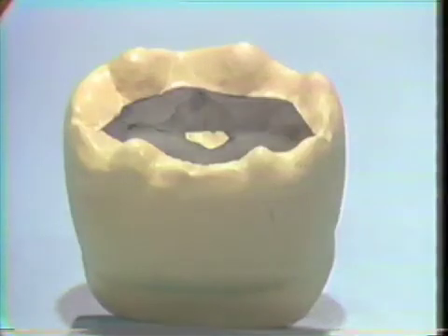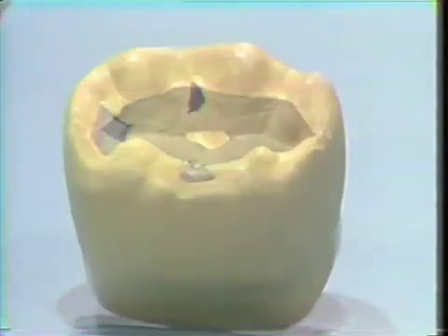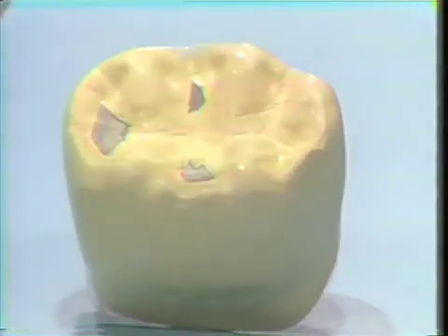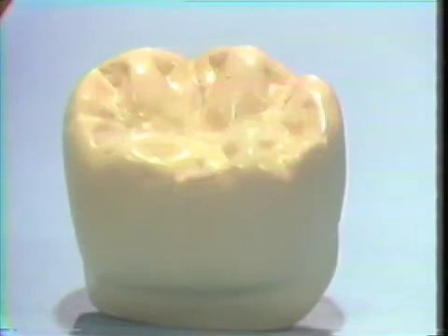Next, we add the triangular ridges, some of the supplemental grooves and escapeways, leading to the final step, which is the perfection of the occlusal anatomy with the supplemental grooves and the details to render the completed occlusal surface of the tooth. Now, with attention to a few of the minor details, the supplemental developmental grooves, etc., we end up with an occlusal anatomy which is not only functional but aesthetically pleasing to the eye.